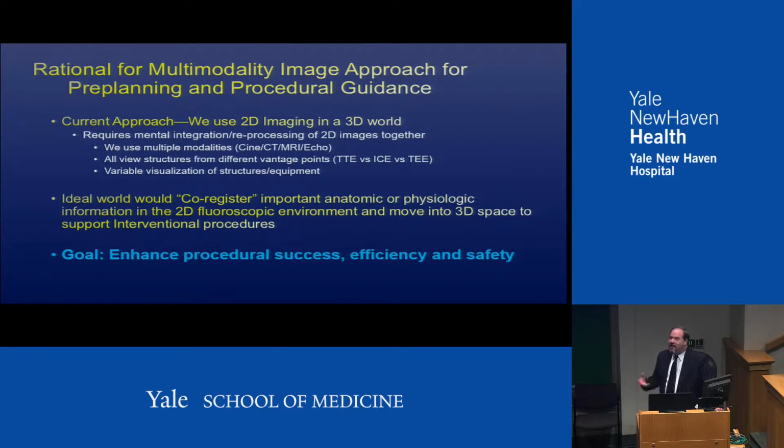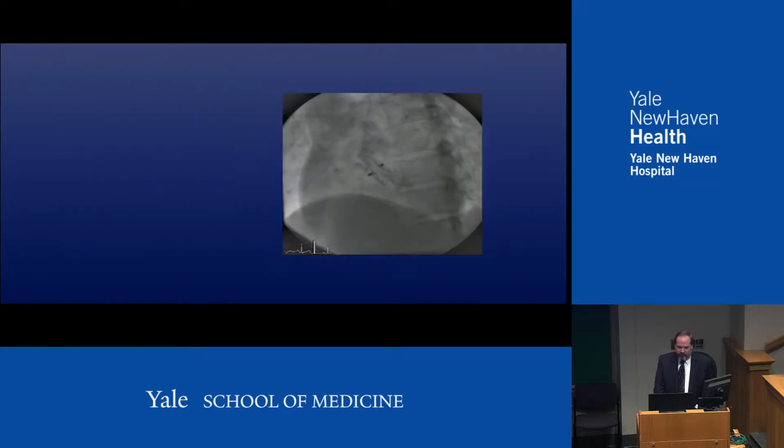So in the ideal world, we'd co-register everything. We'd understand physiologic and dynamic processes in the heart, and we'd move those into a 3D space with the goal to improve our procedures, to include better efficiency and safety. And a lot of that is yet to be proven.